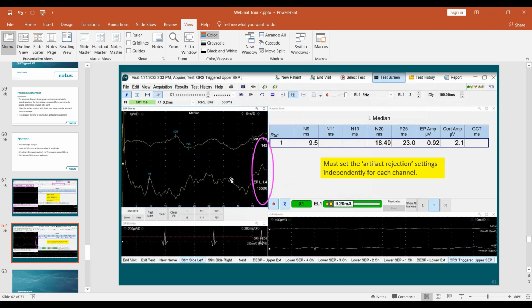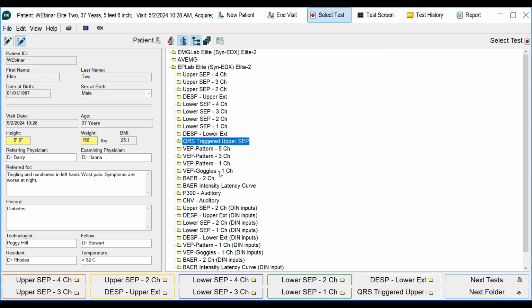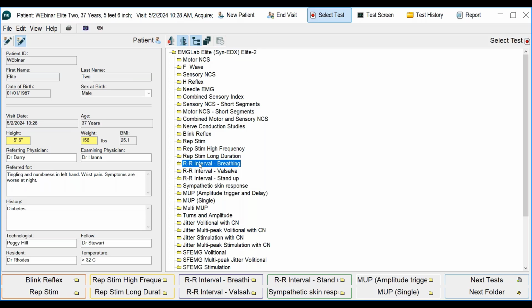Now that we are talking about ECG, let's go to the autonomic function testing. We have redone the autonomic testing. You can see there are programs over here that are dedicated to different maneuvers. So you can do the Valsalva maneuver, you can do deep breathing and so forth. Let me get my electrodes set up over here.